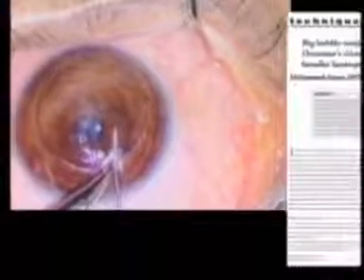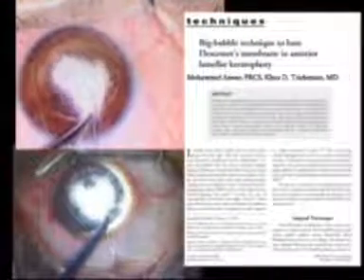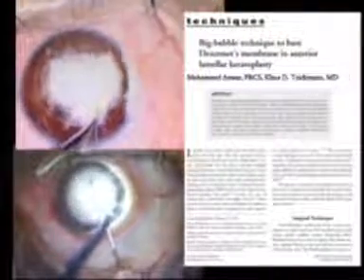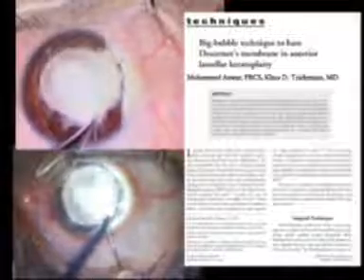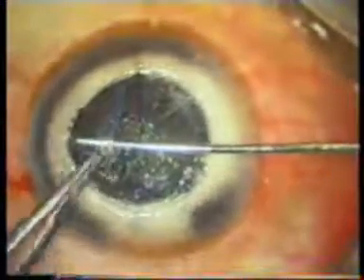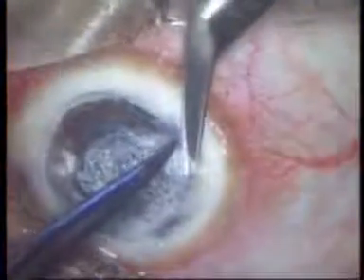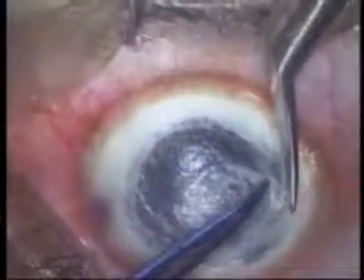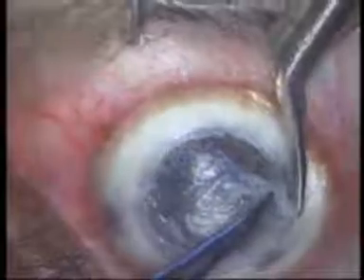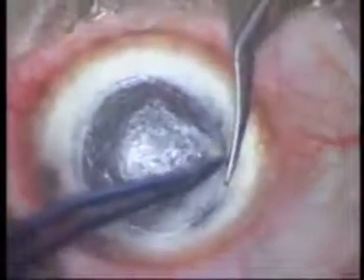The big bubble technique, popularized by Anwar and Teichman, is the simplest and most easily reproducible of techniques, consistently allowing one to reach the Descemet's membrane. In this video, we describe a simplified modification of the big bubble and open dissection techniques of DLKP, using routine instruments available in a penetrating keratoplasty tray.